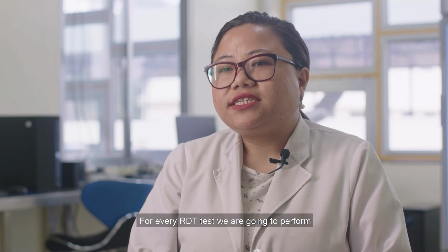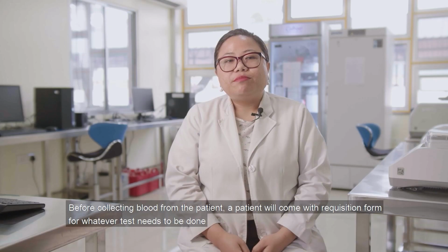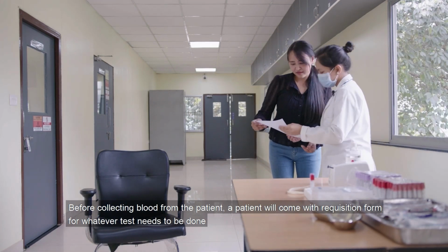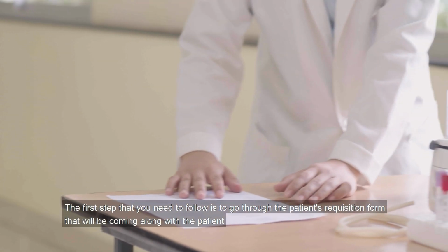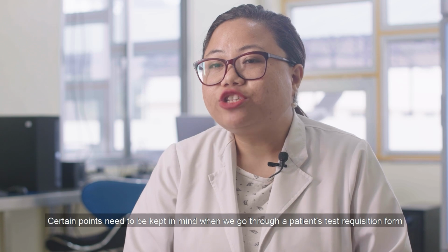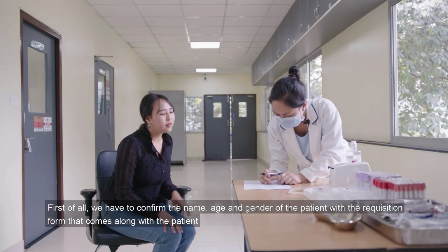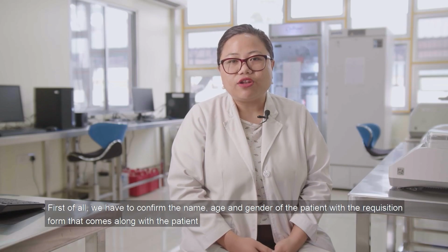For every RDT test that we are going to perform, blood will have to be collected first from the patient. Before collecting blood, a patient will come with a requisition form for whatever test needs to be done. The first step that you need to follow is to go through the patient's requisition form that will be coming along with the patient. Certain points need to be kept in mind when we go through a patient's test requisition form. First of all, we have to confirm the name, age and gender of the patient with the requisition form that comes along with the patient.